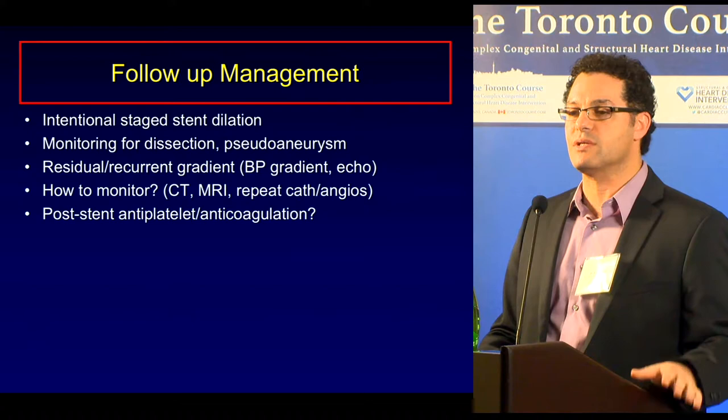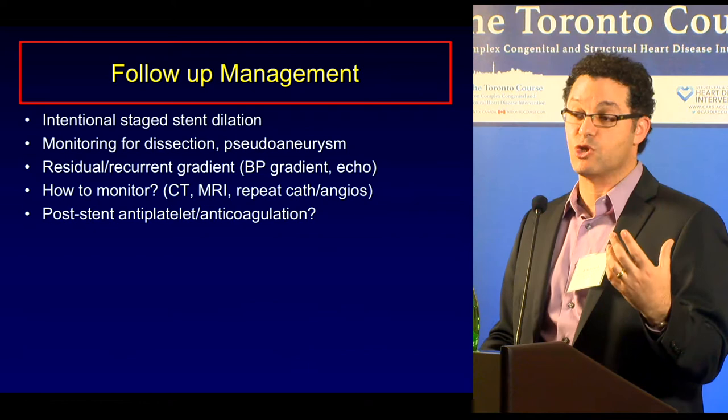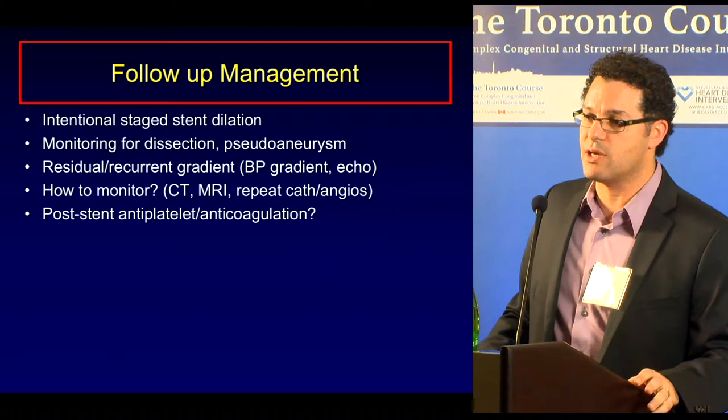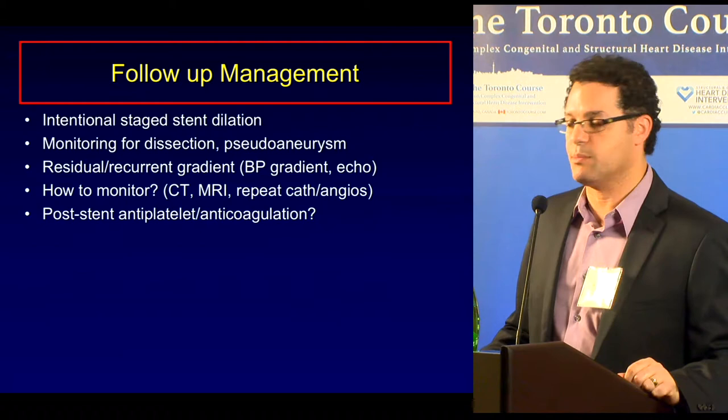And then whether you're using CT scans, which is typically the gold standard, for the covered stents, because of the platinum nature, you can use an MRI with less artifact, and black blood imaging can show you very well inside the stent, and you may pick up pseudoaneurysms. But CT is typically your gold standard, especially with the low-dose radiation that's now available. That's the key.